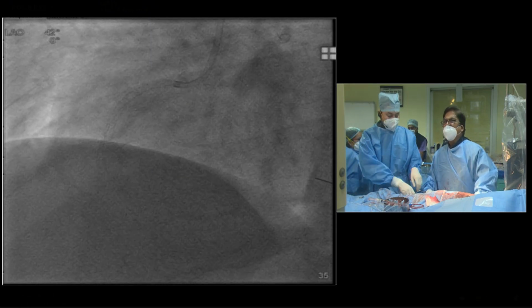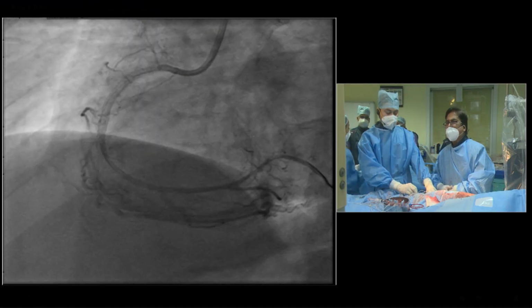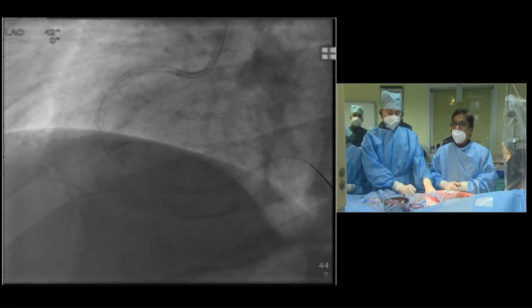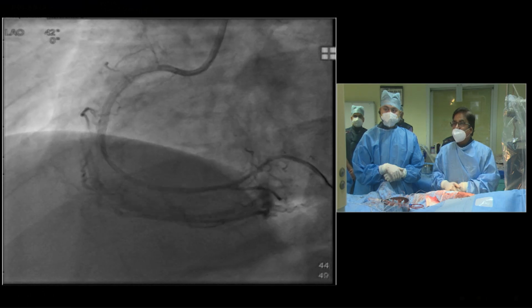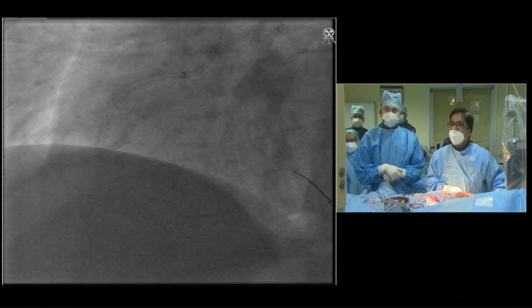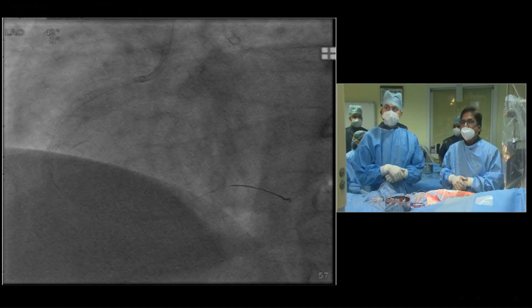Ready? Yes, sir. Come on, inject. Oh, beautiful, huh? Wonderful. And actually, you kept a good case for me. It looks good, yeah. I never expected it to look so good, huh? No, actually we had great expectations. I was actually telling Dilip this will be wonderfully done by Goel sir, and he will keep a very good case for me.